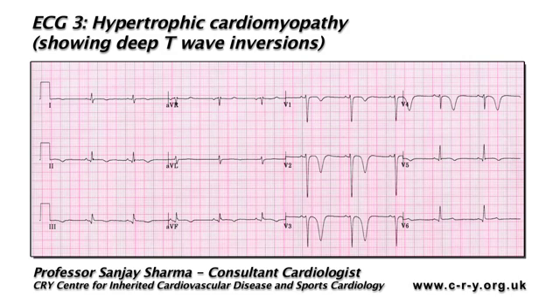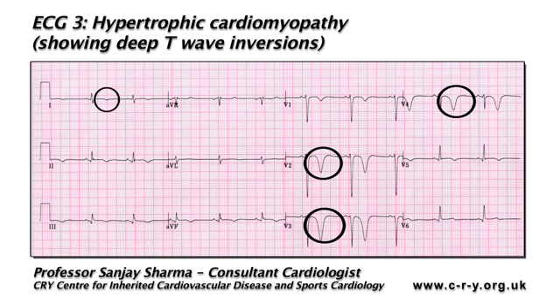This ECG shows deep T-wave inversions in leads V2, V3, and V4, and minor T-wave inversions in leads 1, 2, 3, AVF, and V5.